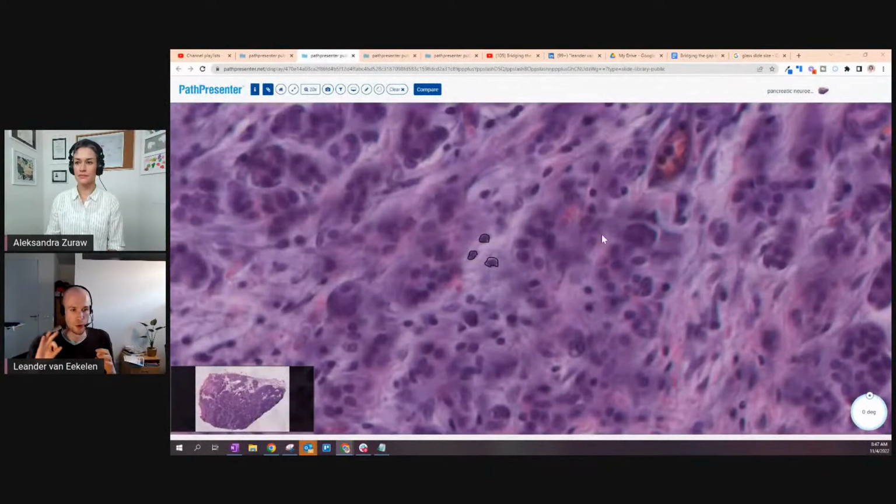So here we get into a distinction between segmenting stuff and segmenting things. Things are countable. Yes. Things represent discrete objects. That might be cells, or nuclei, or glands, or fat cells. A vessel here is going to be a thing, right? Yeah, that's a thing. But then you also have stuff, and these are very informal words, by the way.